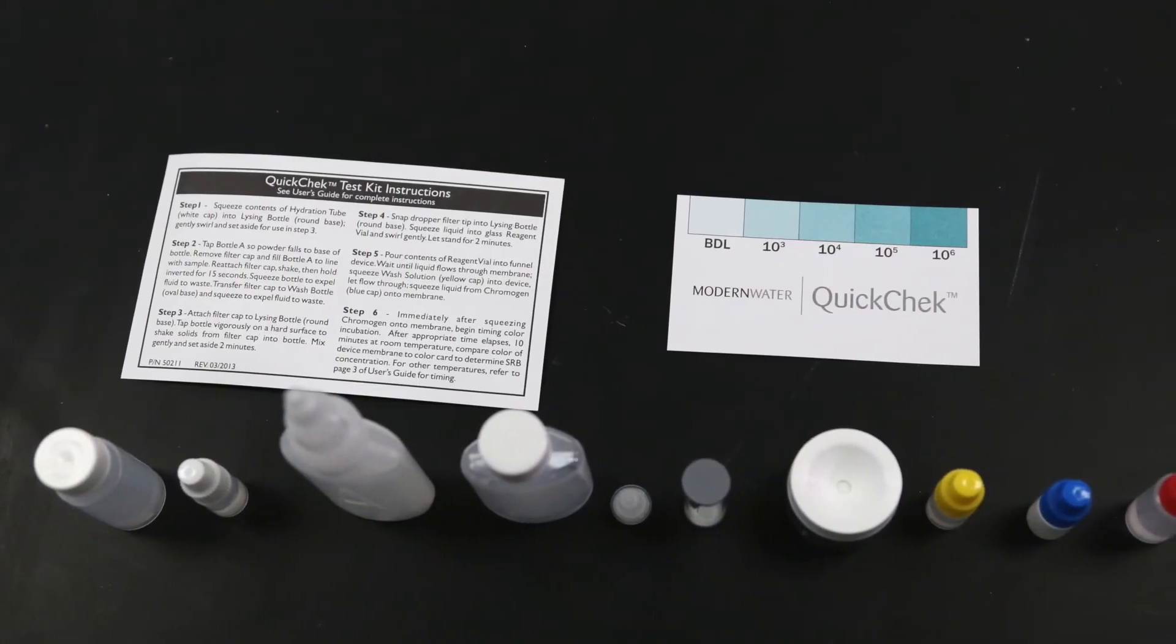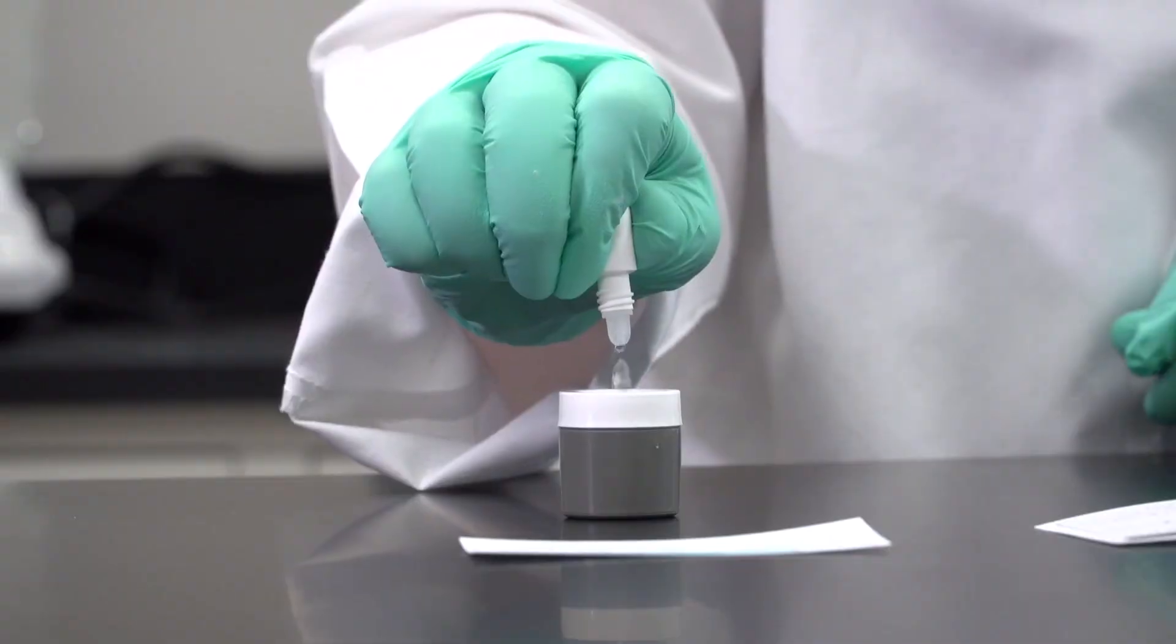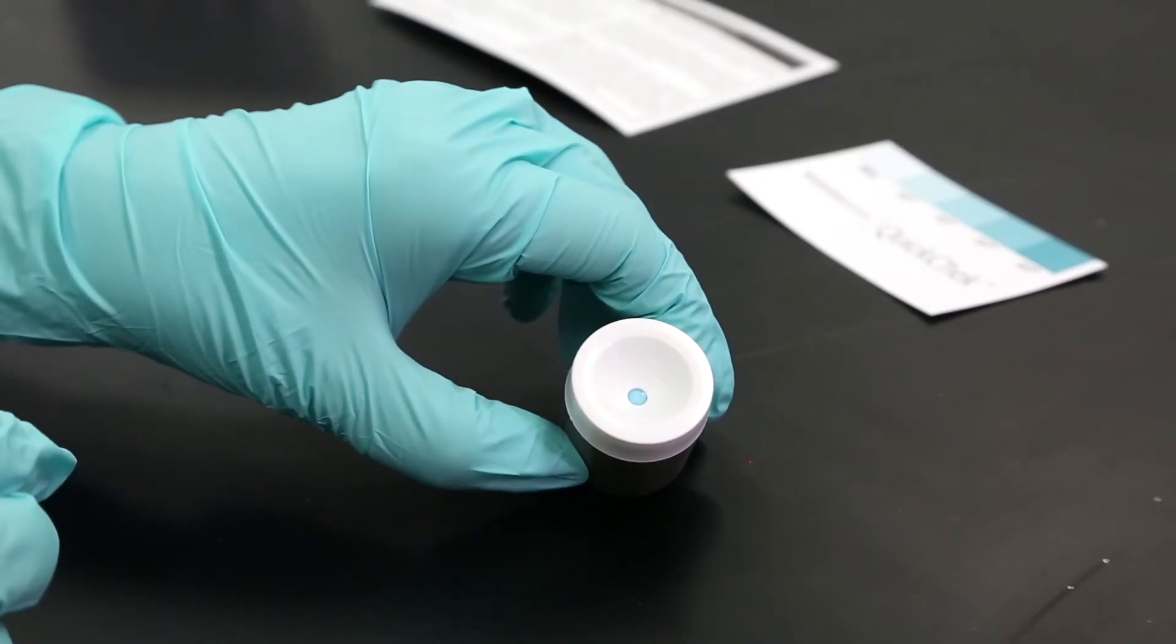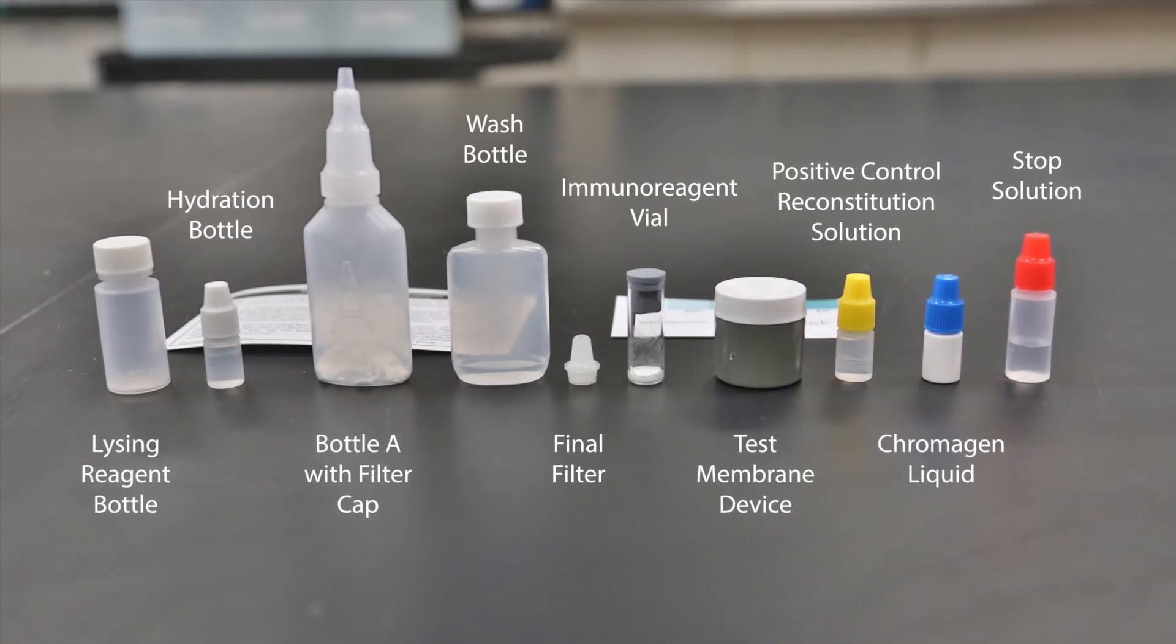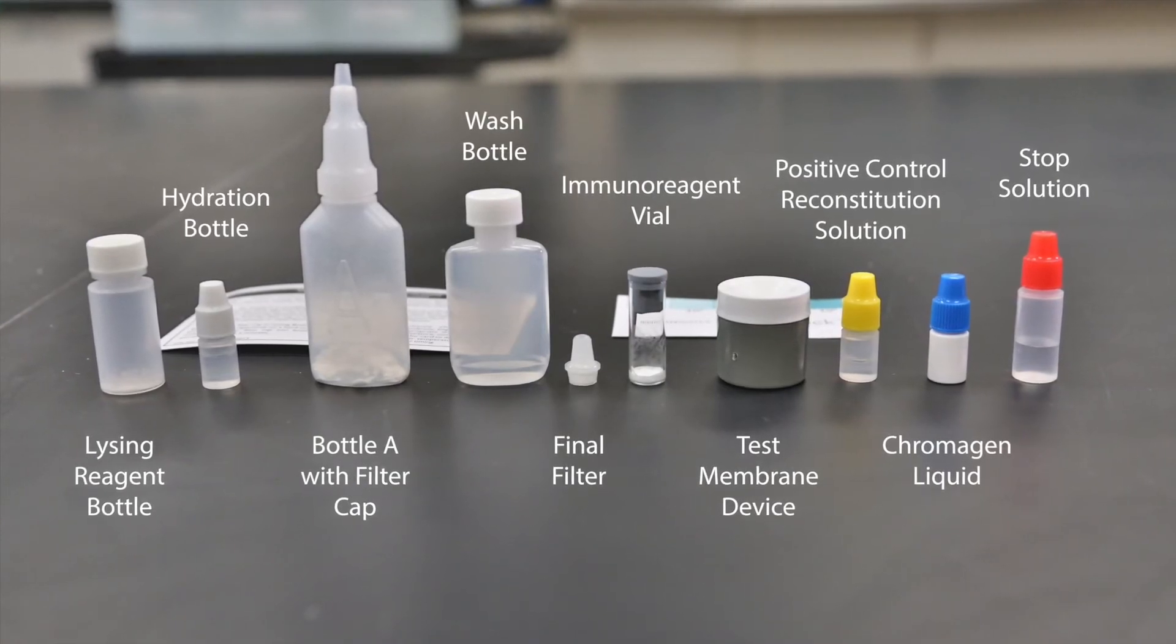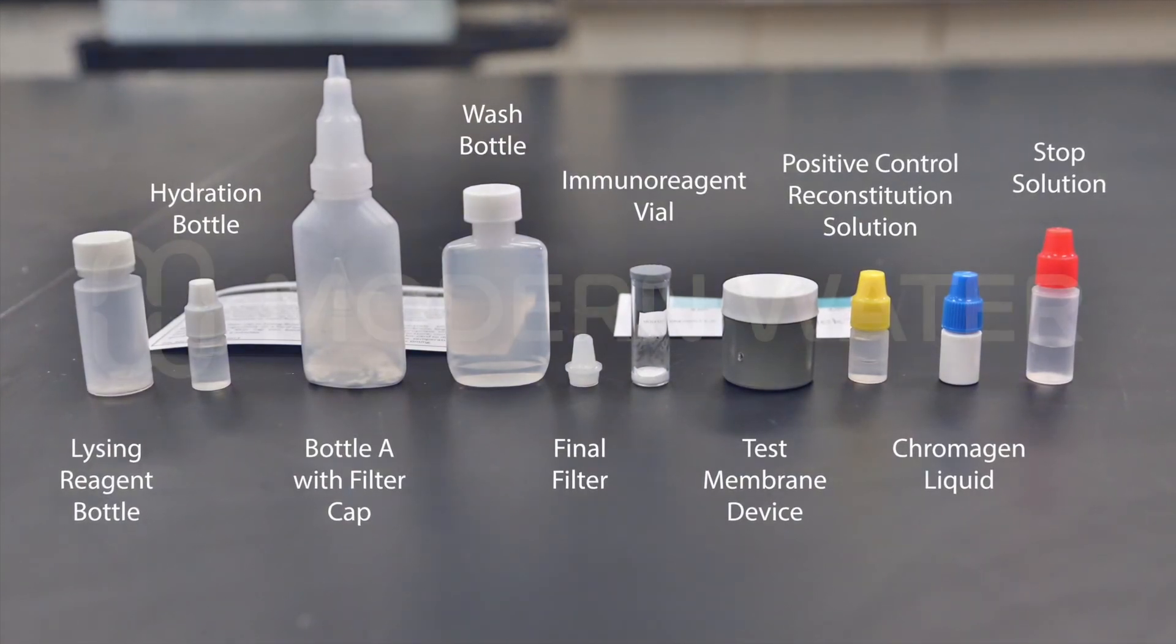The QuickCheck SRB detection system is disposable, completely self-contained, and includes all necessary materials to detect and enumerate SRB. This system is compliant with the new ASTM standard D8243-19 and provides accurate results in less than 10 minutes.